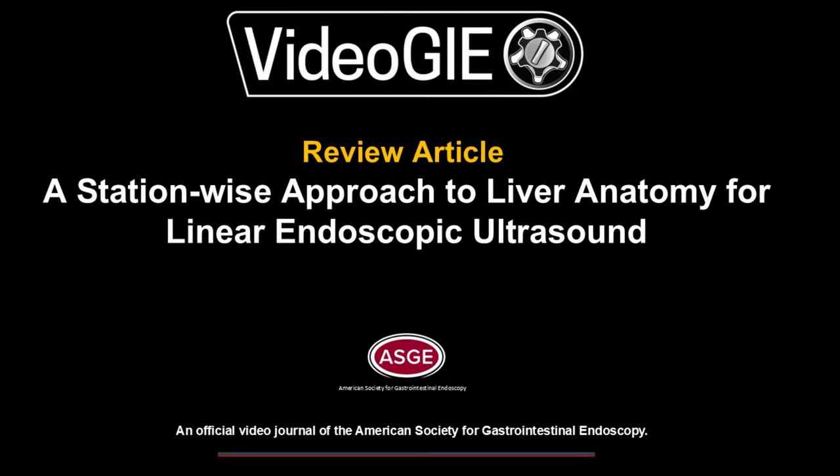This is a video about a station-wise approach to liver anatomy for linear endoscopic ultrasound.